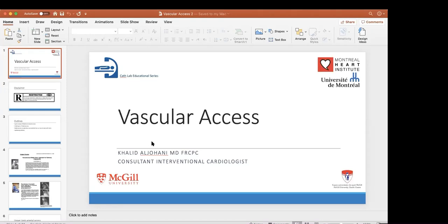Ideally in an ideal world طبعا اذا كانت elective you wait let the INR drift. لكن في الامرجنسي you give dose of heparin. إذا كنت خايف إذا المريض has obvious bleeding like he's bleeding from his gum, don't give or give half dose. بس أنا الصراحة الروتين what I was trained والevidence إنه you have to give it to prevent occlusion.